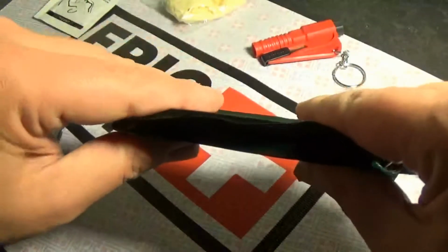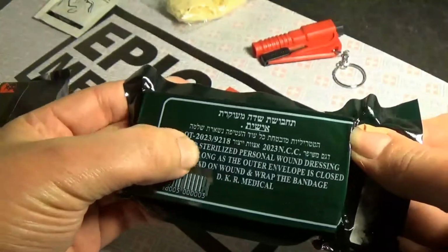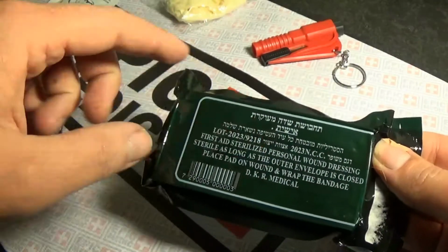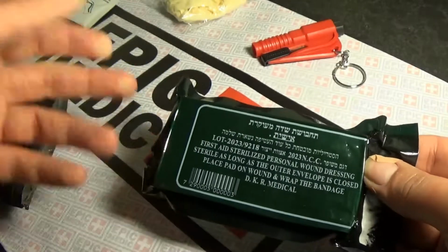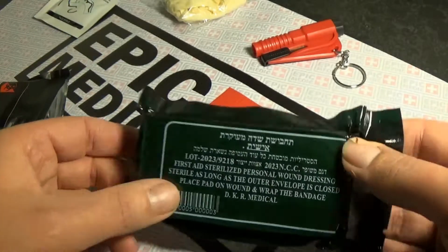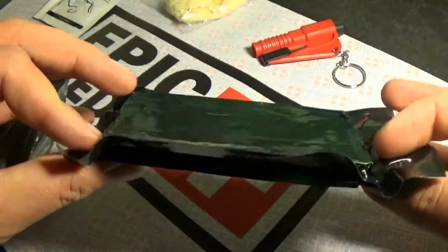Okay, ultra low profile Israeli dressing here. Plenty of time left on this one, and I'll just read it to you quickly. First aid, sterilised personal wound dressing, sterile as long as the outer envelope is closed. Place pad on the wound and wrap the bandage. This is a genuine Israeli, so that's really smart actually.